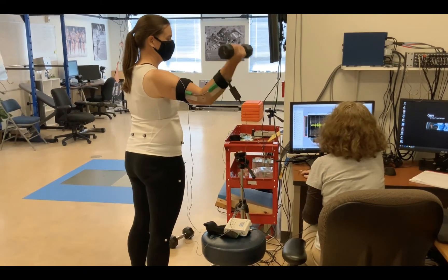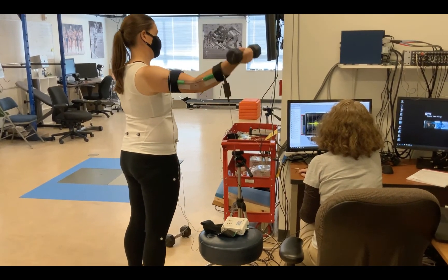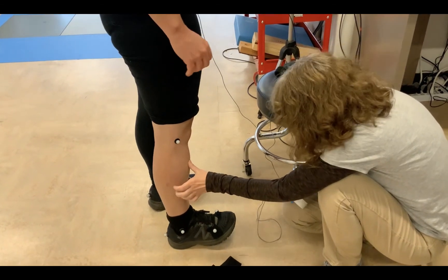You can have them do a lot of contractions and do a pre-post fatigue sort of analysis. You can do things where you take the sensors on and off and put them back on.